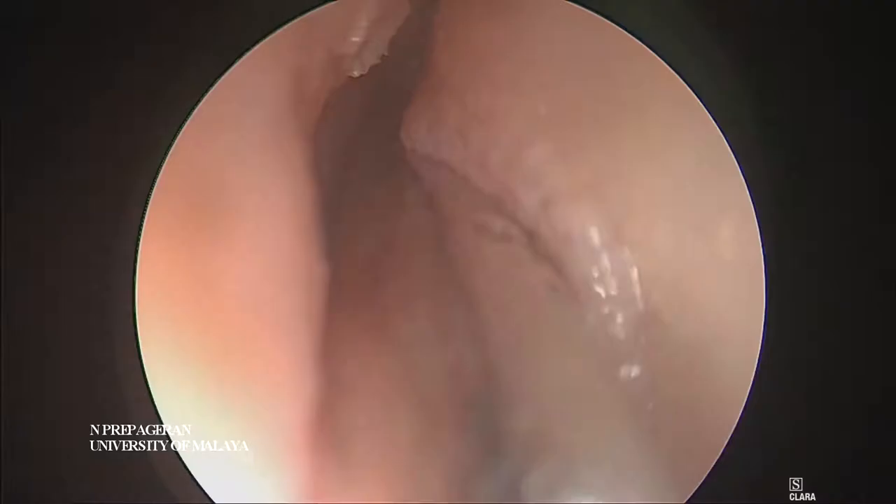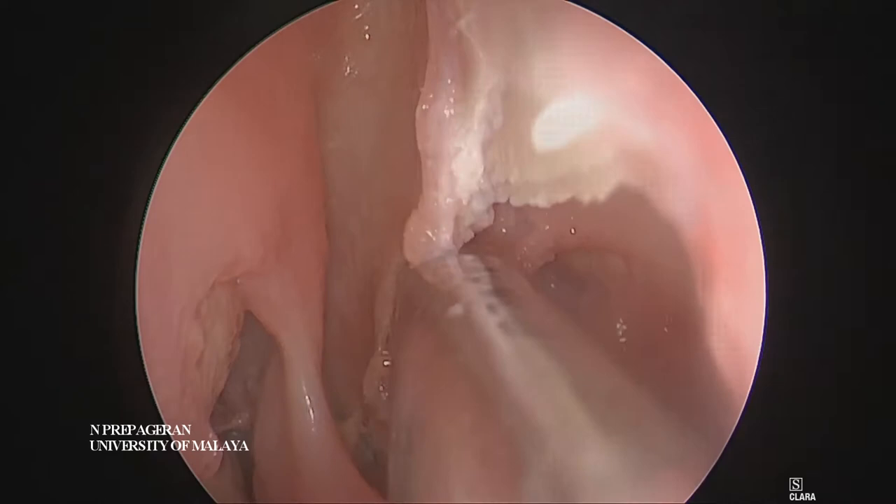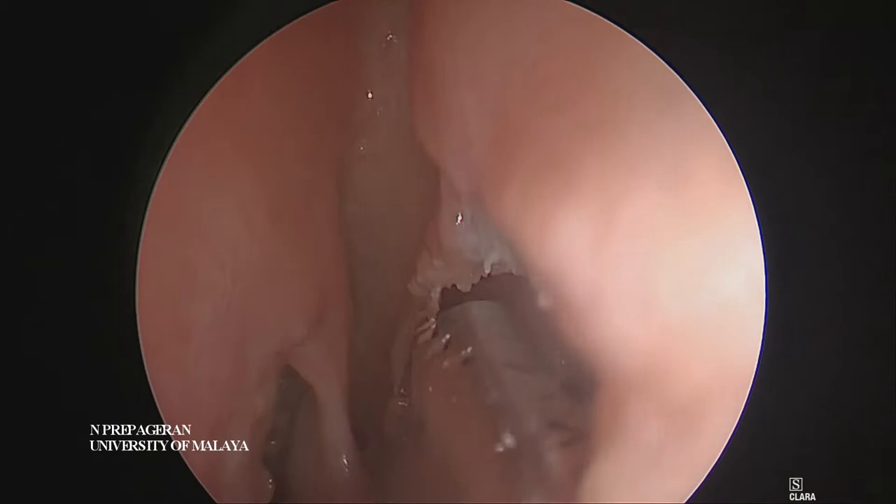What we are going to do is a modified Lothrop for you guys. Once you are able to see where the middle turbinate on both sides meets, then half of your problems are over. After that, it's quite easy to do a Lothrop.